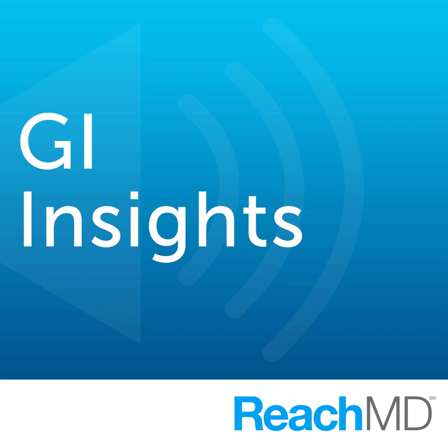And what are the benefits of using ultrasound to assess inflammatory bowel disease? Well, there's a couple things that this has really brought to our clinics and to our patients. The first one is just the obvious, which is that by getting an answer right away, it doesn't require that the patient handles their own stool or that we're waiting for a result that comes back from a lab, or that the patient has to be prepped and have a scope or wait and then have a scan that requires interpretation by a radiologist. And therefore, we have the information we need to make decisions in real time.